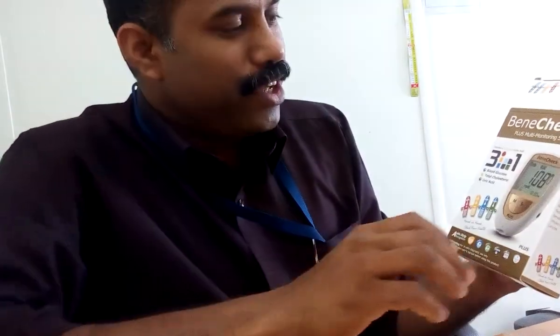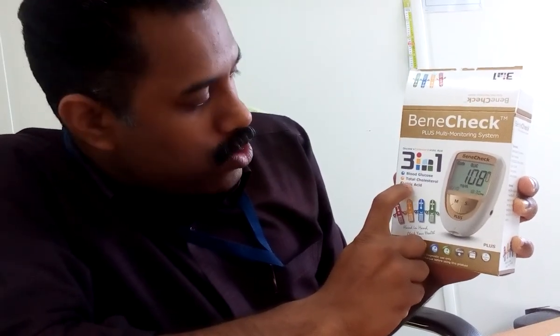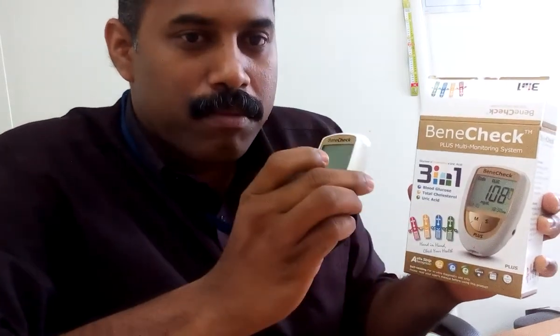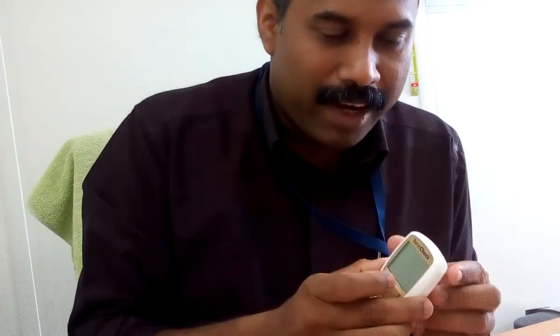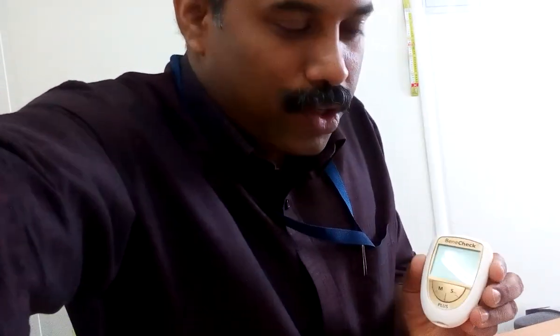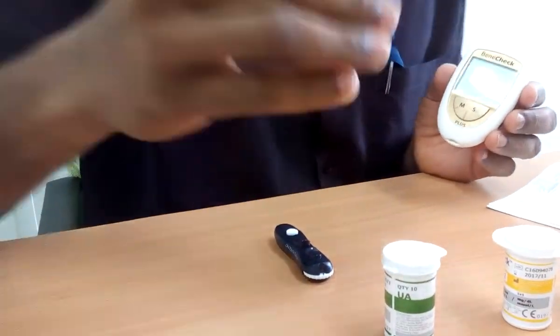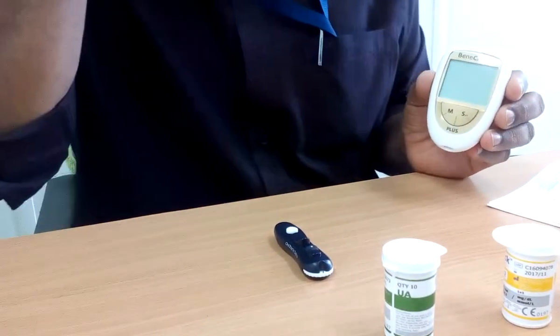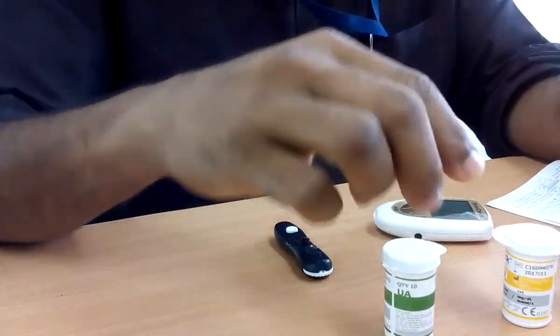Hi friends, I received a new machine which can be utilized for checking blood glucose, total cholesterol, and uric acid in a single machine. This is actually new to me, so I am planning to have a test. Let us see how it works — it will be new for you that all three can be checked in one machine.